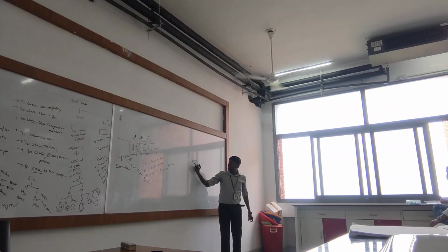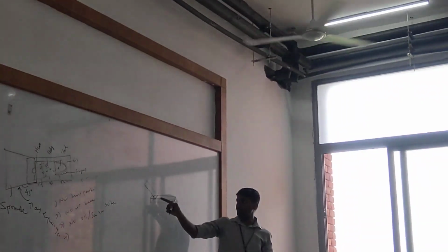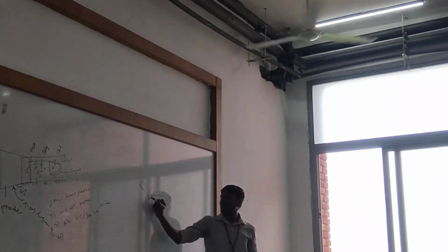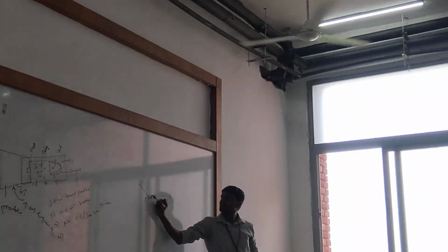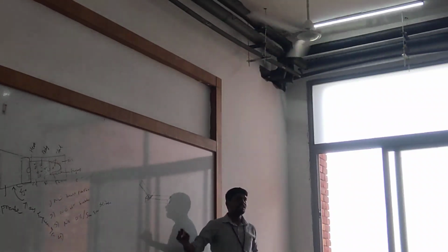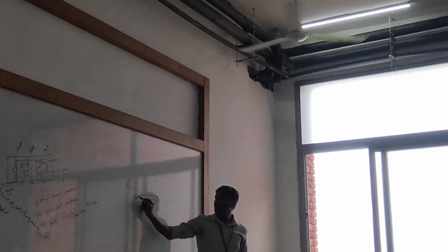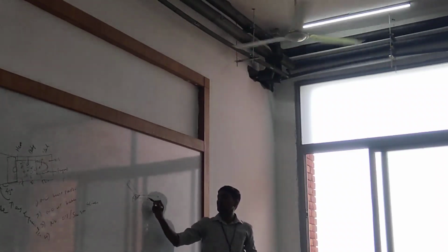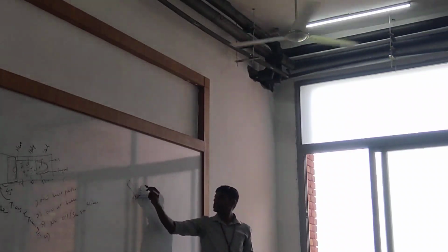Next one. Keep the spreader in front of the blood. Now slowly bring it back, maintaining your 45 degree angle. Once you get in contact with the blood, the blood will spread along the entire spreader like this. That is because of capillary action. The fluids will spread. Now the blood has spread. Immediately, once it is evenly spread, give a forward quick stroke like this. A forward stroke. That's it.